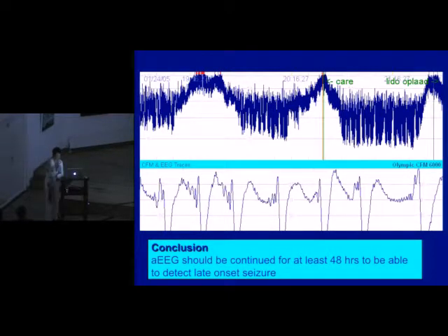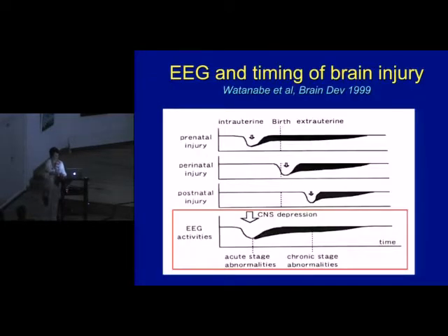So we think that this is a sign of secondary energy failure after a severe hypoxic ischemic event. And actually the background pattern deteriorated severely in this baby, and eventually this baby died. So it's all about timing of the insult.